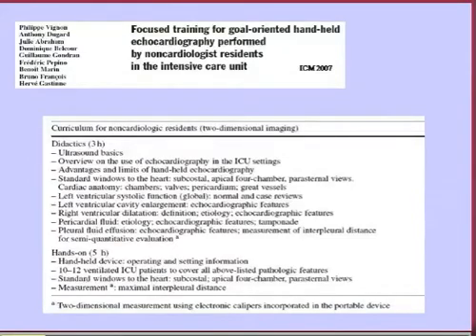The intensivists were confident regarding these different kinds of patterns to look for hypovolemia, to look for LV dysfunction, to look for right ventricular dilatation. So very focused training, 3 hours didactics, 5 hours hands-on session. Of course, you can do better, you can do more.